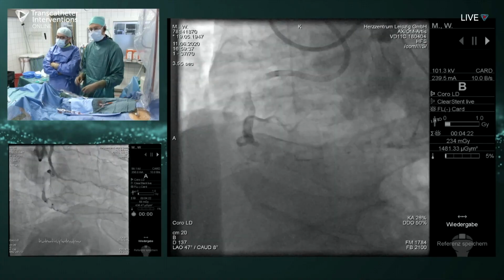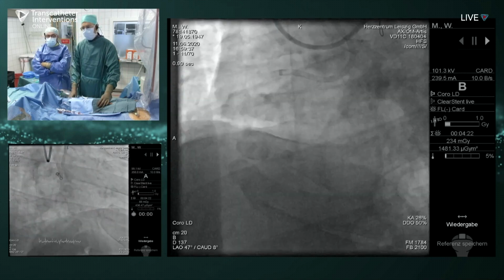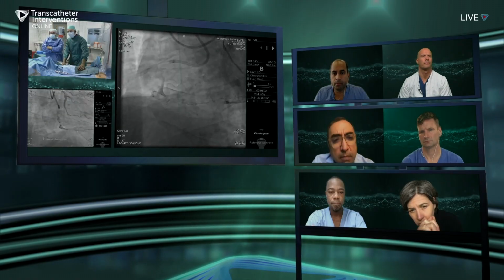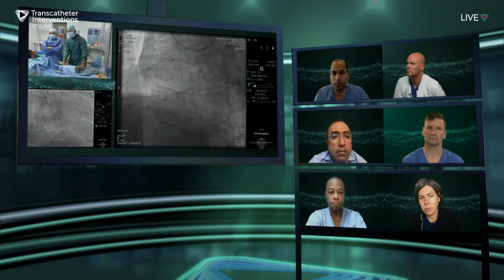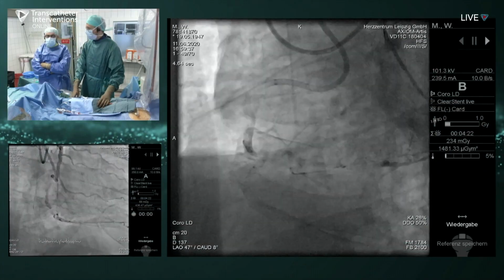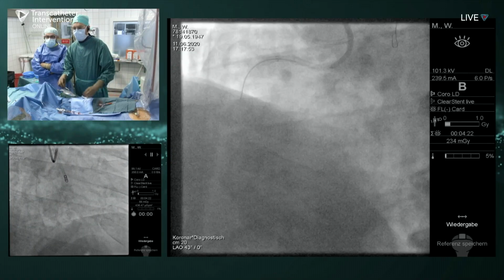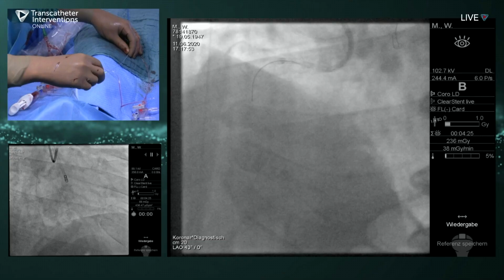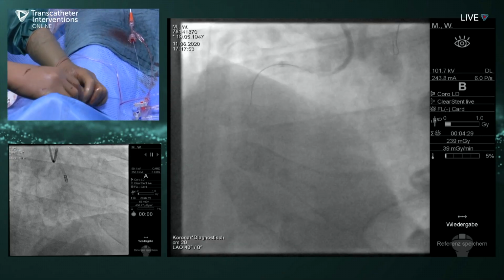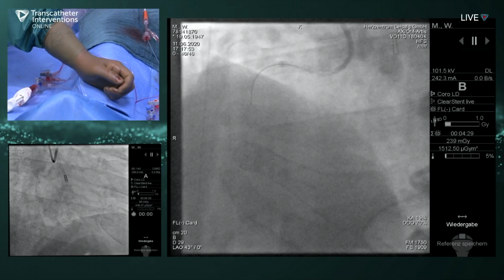Yes, totally agree. I already forwarded a microcatheter down to the proximal cap, and I think antegrade wire escalation is a good frontline approach because we have a tapered proximal cap, as you said already. So, as you can see, the microcatheter is already down next to the proximal cap. It is a Fine Cross, 130 centimeters.